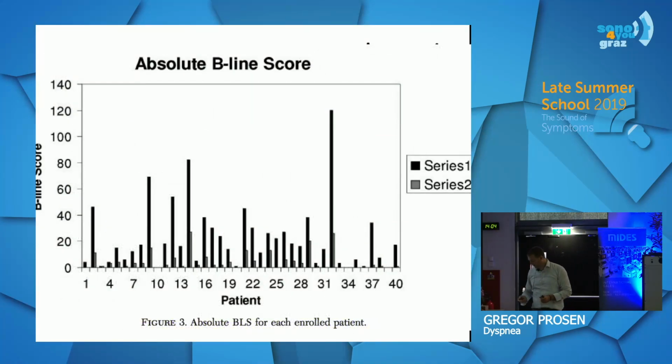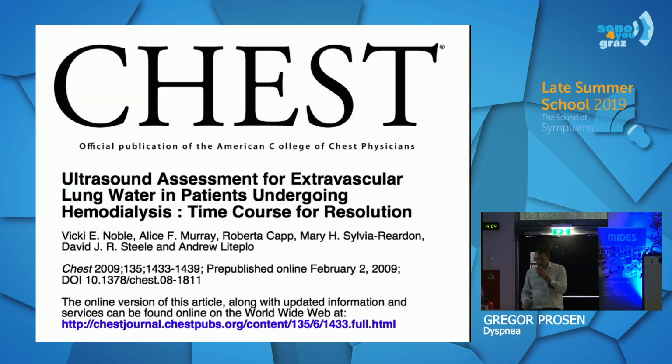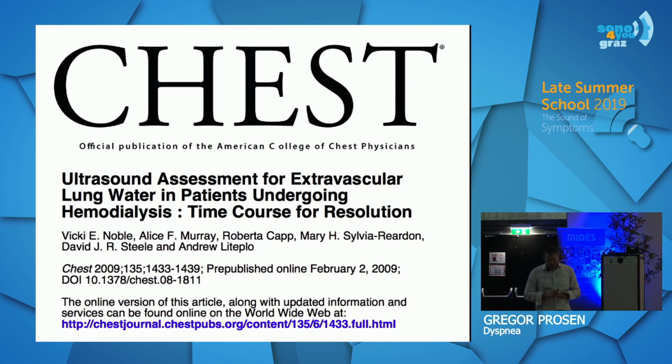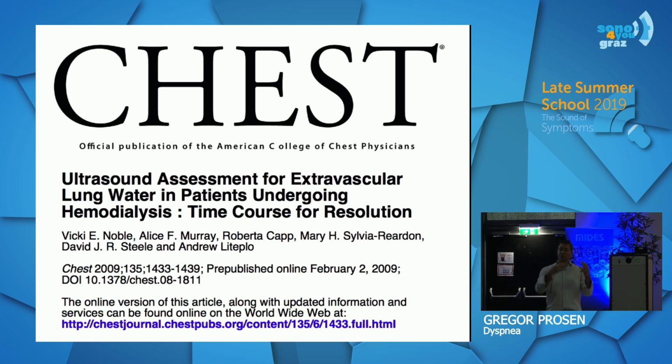Another beautiful study I want to show you, not for the sake of studies, but for the sake of how smart people are. This lady, Dr. Noble, is really a pioneer of lung ultrasound. What she realized is that we could also monitor this concept of the lung being wet, being full of water, in hemodialysis patients.